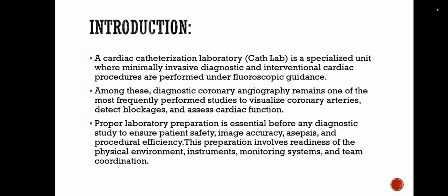Among these, diagnostic coronary angiography remains one of the most frequently performed studies to visualize coronary arteries, blocked arteries, and also to assess the cardiac functions.